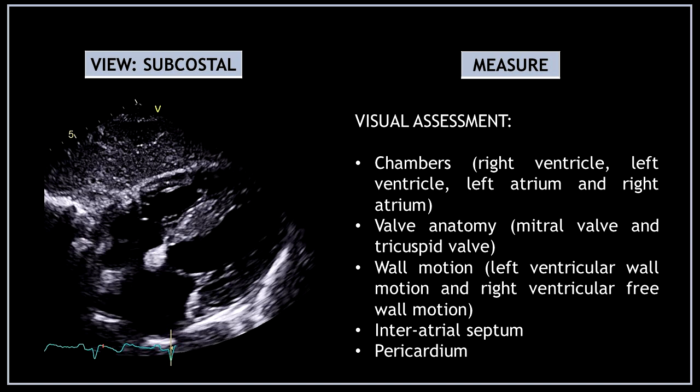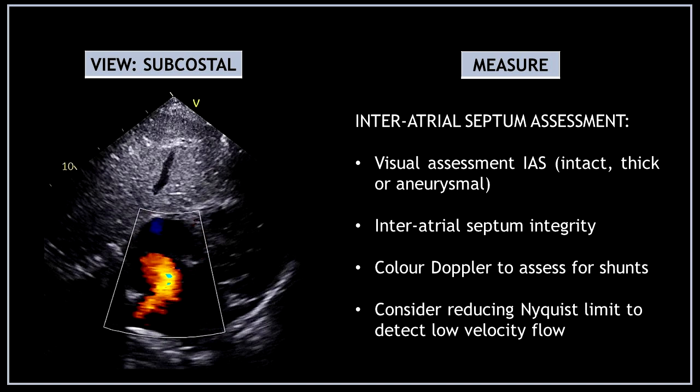Have a look at the inter-atrial septum and the pericardium. For the inter-atrial septum assessment, visually assess it and report if the septum appears intact, thick, or aneurysmal. Use color Doppler to check the inter-atrial septum integrity and to assess for shunts, and consider reducing the Nyquist limit to detect low velocity flow.